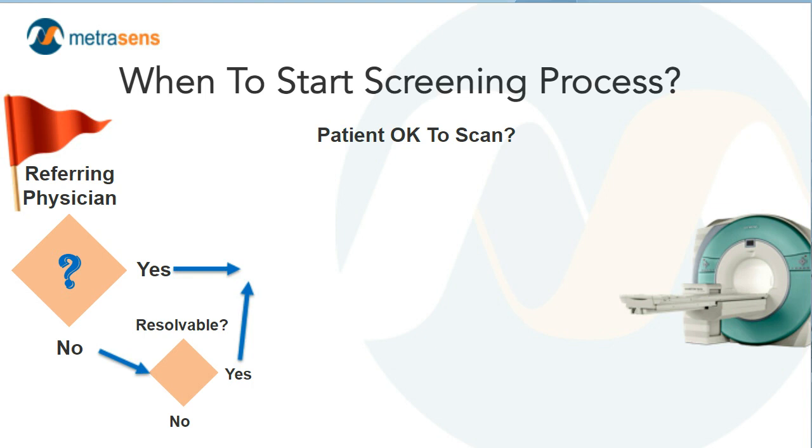What if the patient has a pacemaker, right? Well, if you can identify those questions and resolve the question, oh, it's an MR conditional pacemaker, not a problem. We do MR conditional pacemakers on Thursdays when we have the cardiology staff in the department. Well, now you have all the information you need to be able to proceed, and so you resolve that question and the patient moves on towards scheduling.